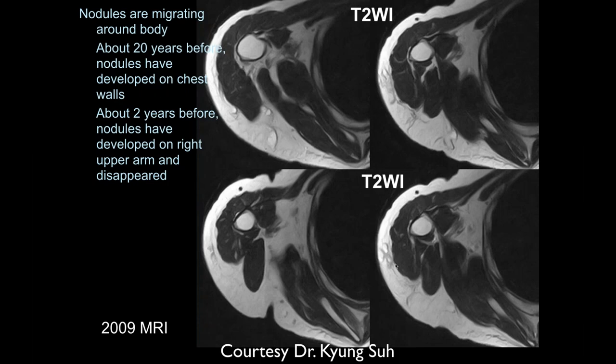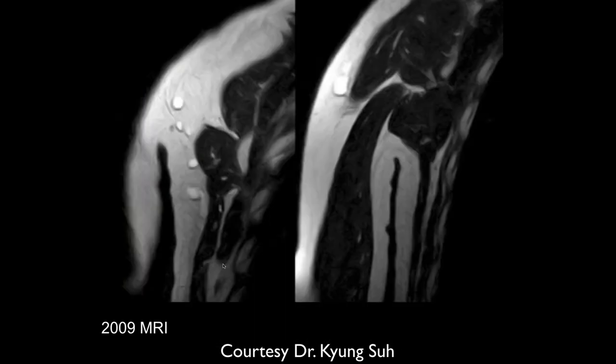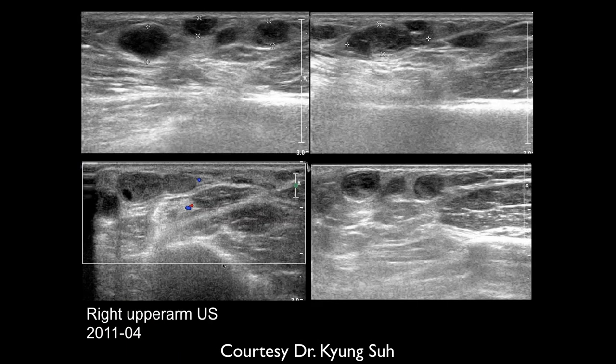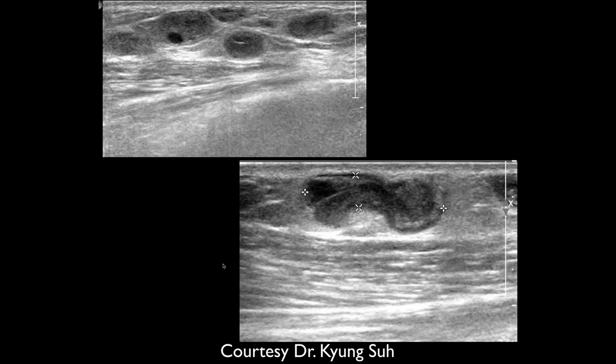Here's what the T2 looks like. So on T2, the same signal intensity as fat. Yeah, some areas may be slightly brighter, but that's right. So yeah, so they could be fluid filled. Yeah, right now it sounds like some fluid filled or cystic structures, and on ultrasound, they're not simple. They actually turn out not to have any flow.